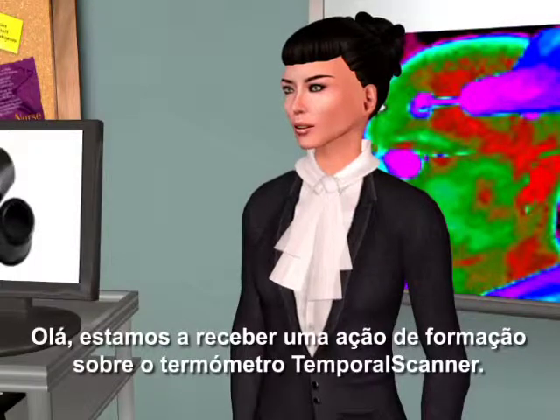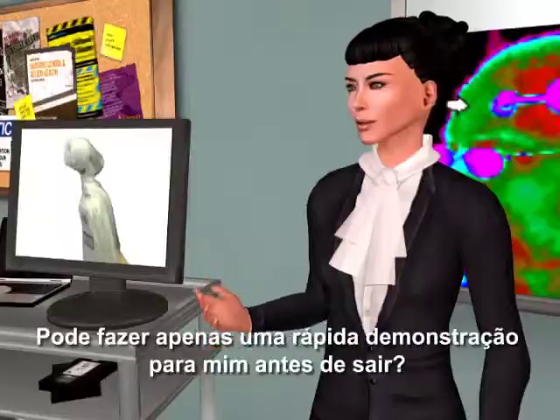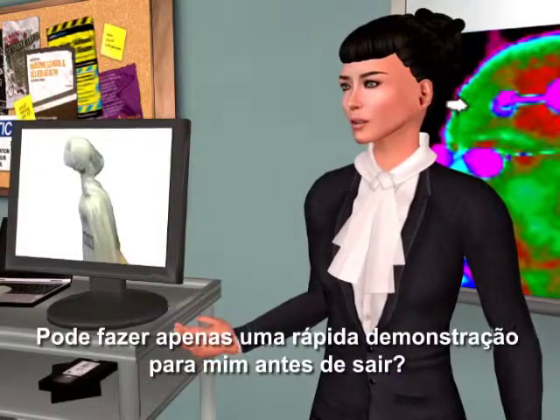We're having an in-service for the temporal scanner thermometer. Will you join us? No, don't need to — I already know how to use it. Would you just quickly demonstrate for me before you leave?